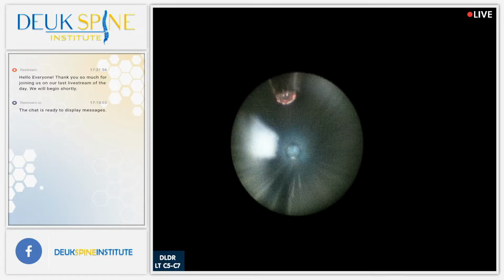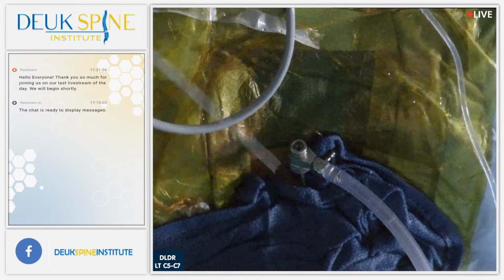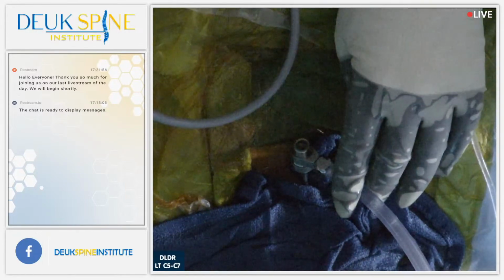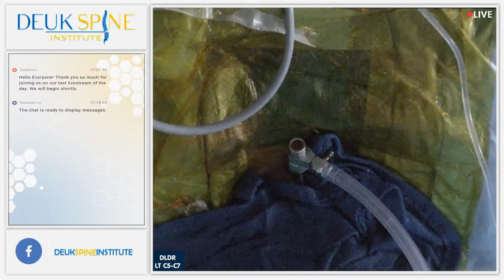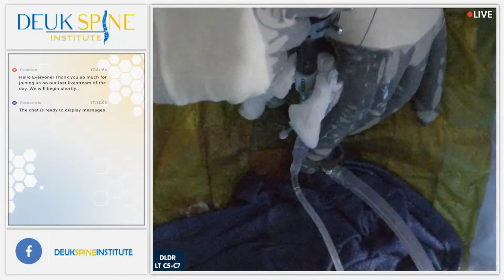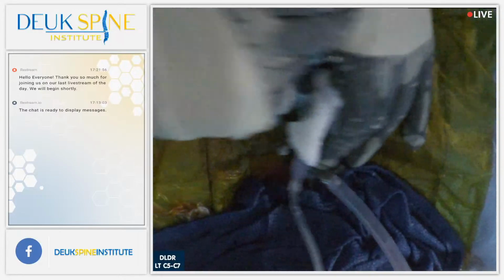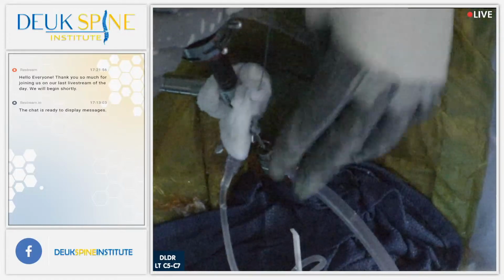All these things here are pieces of herniation, all these fragments. There's a big one right there. Let's get that one out. That's a big one, 5 millimeters. Remember, pinch from the side, not up and down. Okay, now we're starting to see a little more blood because, well, when you start getting the herniation out of the foramen, the little veins start bleeding. You can see we've gotten everything cleaned out except over here. So I'm going to work on this corner. It's just so many fragments.